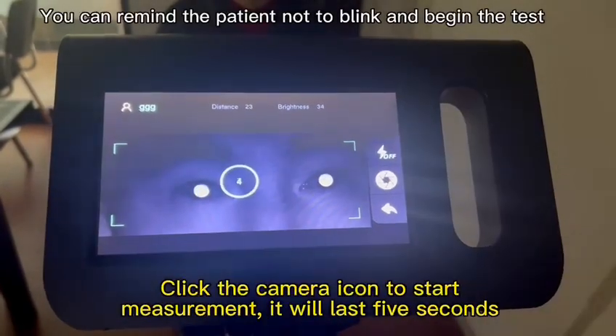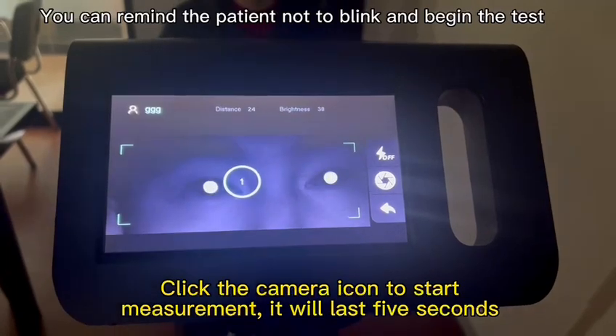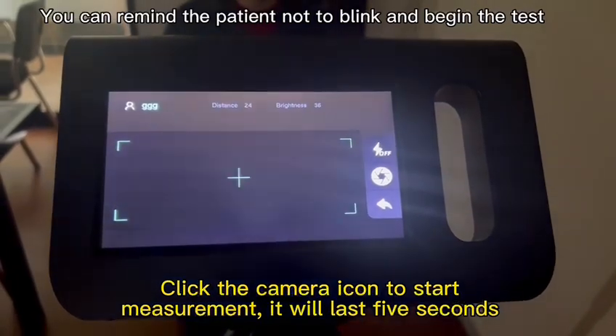Click the camera icon to start the measurement. It will last 5 seconds. Fix the gaze.